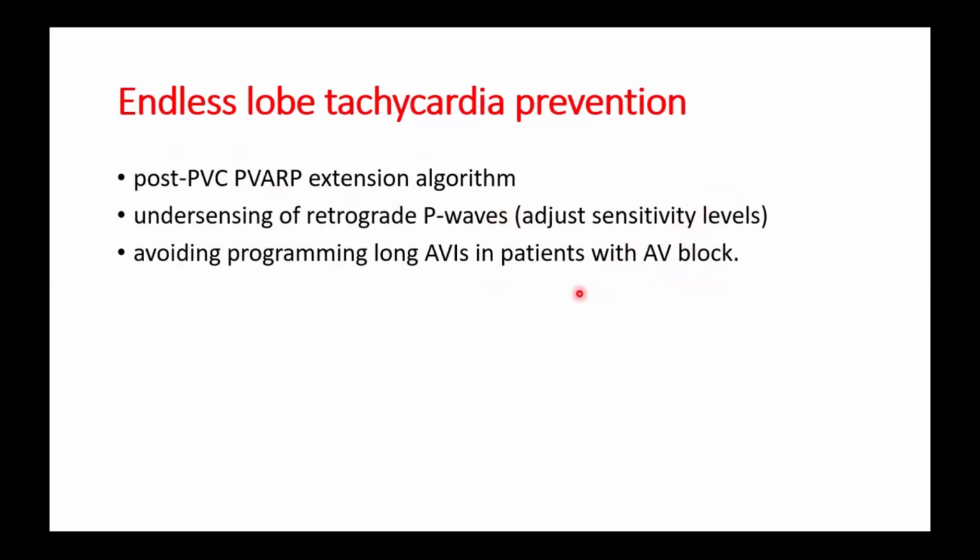Actually, I don't have an exact number, but if you are programming a long AV interval with intrinsic conduction and you notice PMT, and there is no other explanation and there is good conduction during normal sinus rhythm, ventricular pacing should shorten the AV interval.